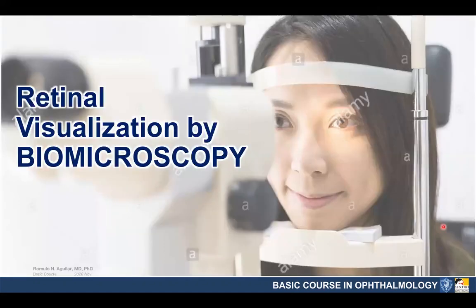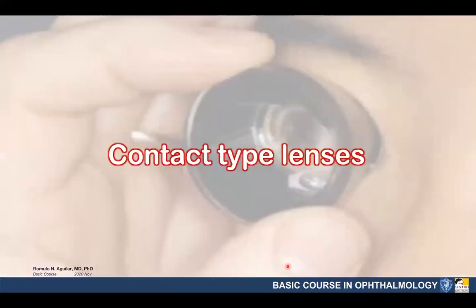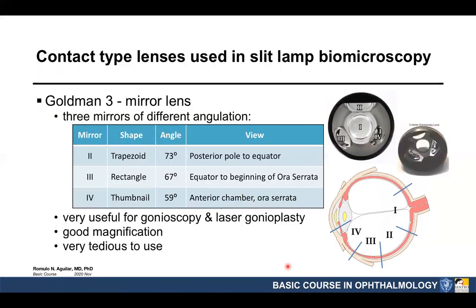Now, another way to visualize the retina is by the use of the slit lamp. So if you don't have an indirect ophthalmoscope, it should not stop you from having a full view of the retina. If you have a biomicroscope, you can use that in conjunction with either contact type lenses or your non-contact type lenses. Let's start with the contact type lenses. The mother of all contact type lenses would be your Goldmann 3-mirror lens.